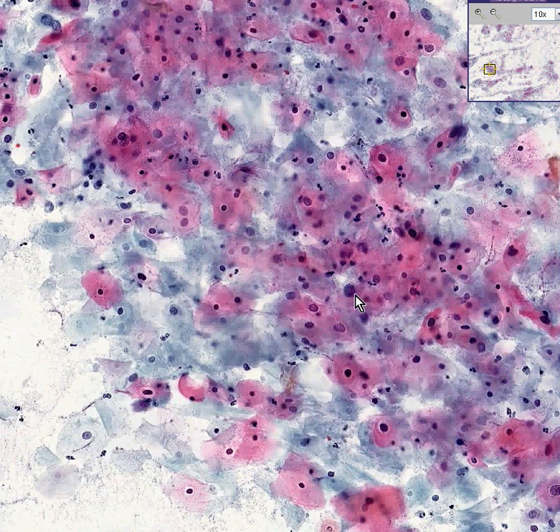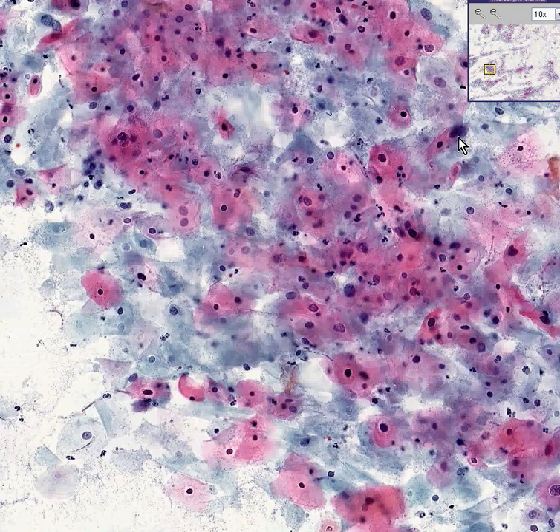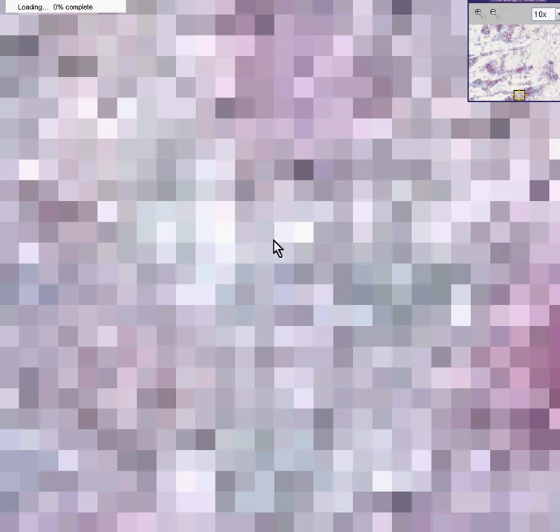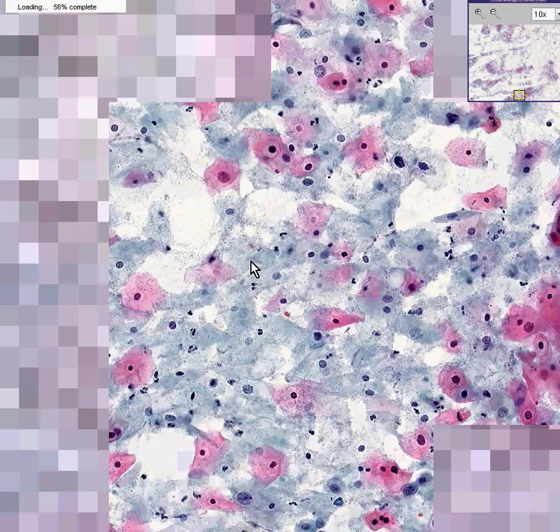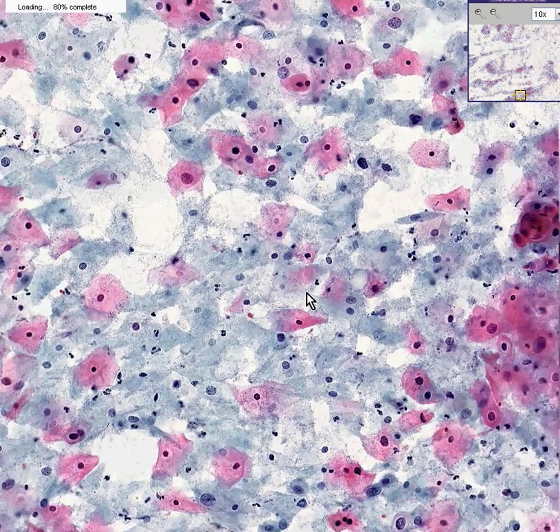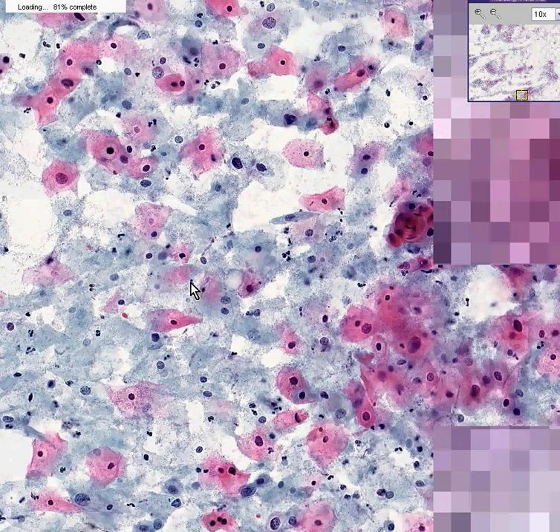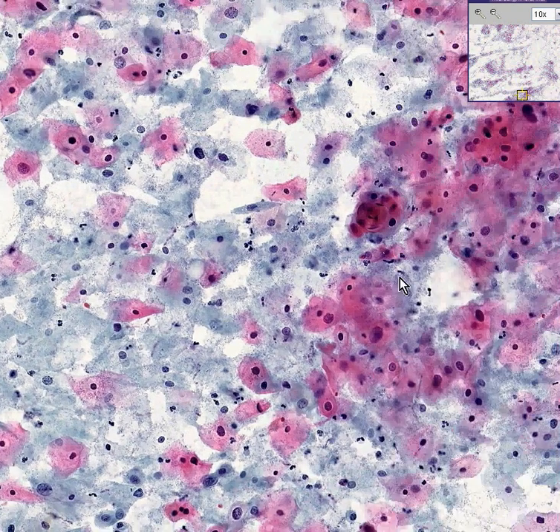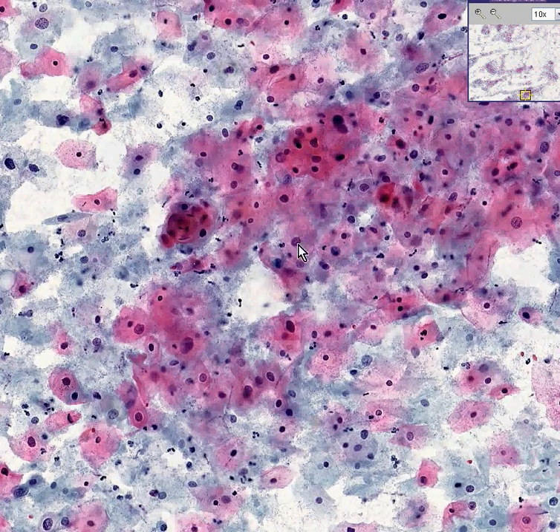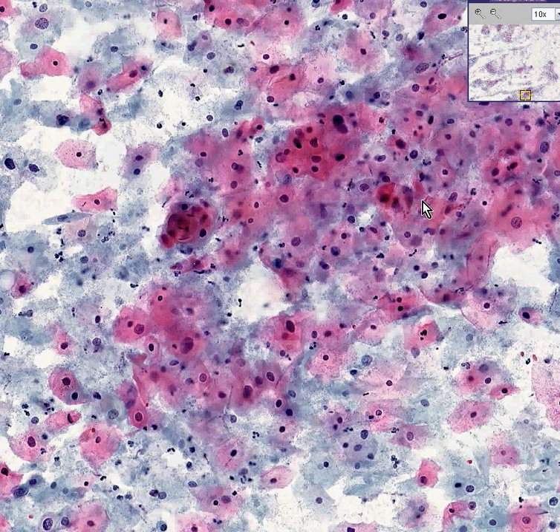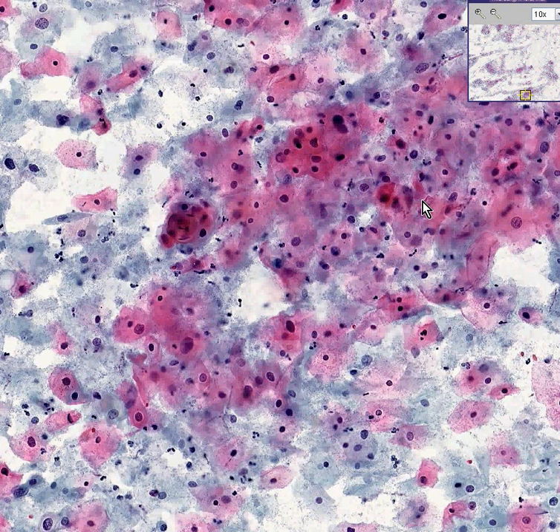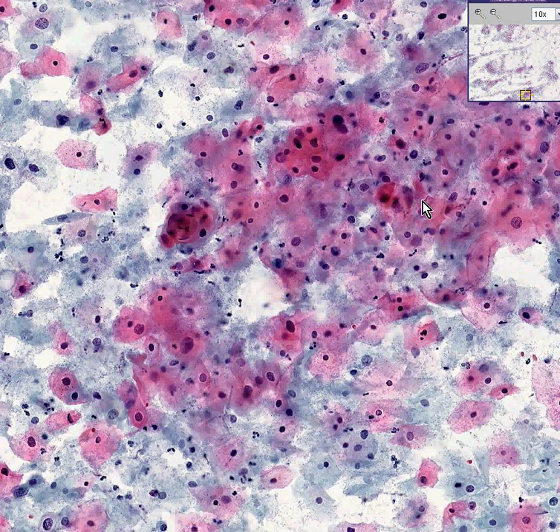Here are some suspicious cells. There's a large, irregular, darker than usual nucleus. Here's some as well. This is another case of high-grade SIL, formerly called CIN Roman numeral III, also formerly called severe atypia, also formerly called severe or high-grade dysplasia.